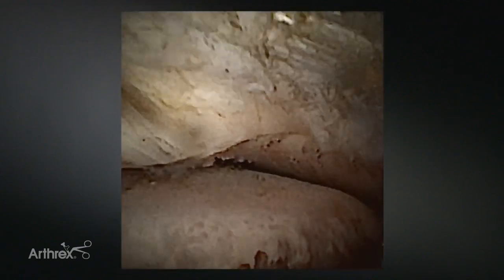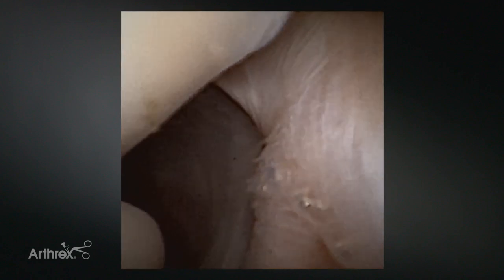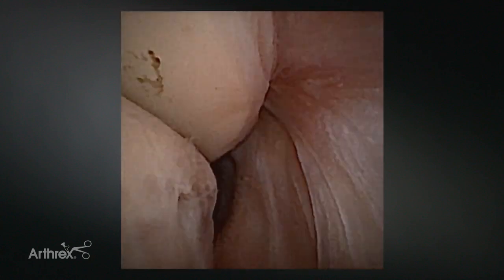This is the subtalar joint — a joint they tell us isn't really scopable. But with nano needle, we can get in here. For all my subtalar fusions and calcaneus fractures, I'm using nano needle for this reason. The 120-degree forward viewing is perfect because you're never going to see this view with a 4.0 scope — it's literally impossible. Visualizing posteriorly with nano needle being so small, we can actually look at the lateral aspect of the subtalar joint and take it all the way to the anterior subtalar joint and posterior facet. Being able to see this gutter and retrieve loose bodies or evaluate instability right here is also very nice.